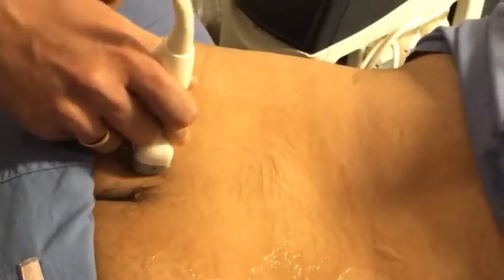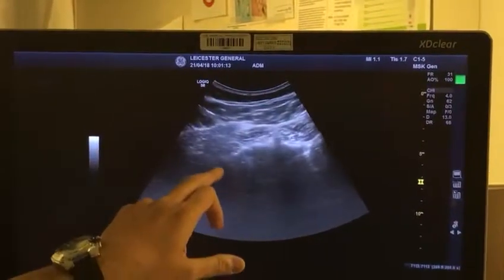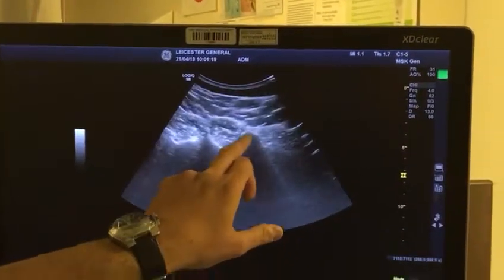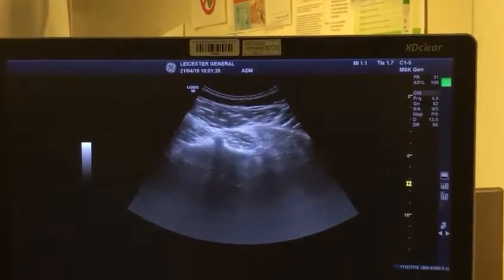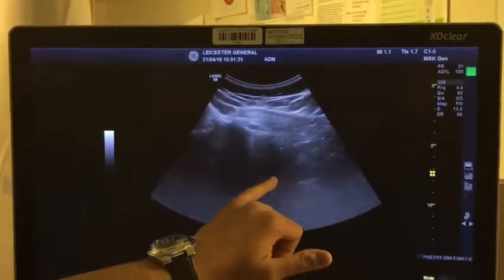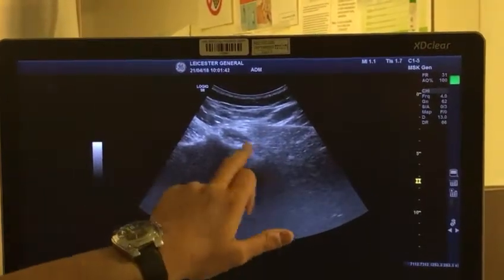All right, the sacroiliac joint. The way to do the sacroiliac joint is you start to scan in the midline. This is what I call a seagull sign, or the medial sacral crest. You're looking at the sacral crest, and that's basically your PSIS, posterior superior iliac spine. Then I come down, and when I start to see that, that's the S1 foramen. Then I come down a bit, then I see the S2 foramen, and then I move a bit more laterally. And you see the gap there? That's your sacroiliac joint. So this is the lateral sacral crest, ilium, sacroiliac joint.